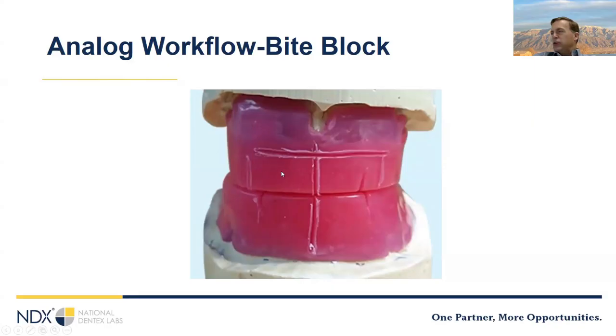Last but not least, make sure you check the labial support for the lip so that the patient has good lip support. And you can take pictures of your patient wearing the bite block. That can really help your laboratory as well.